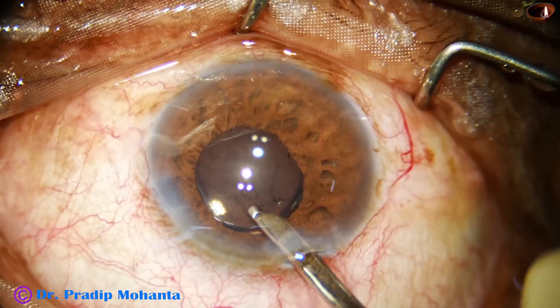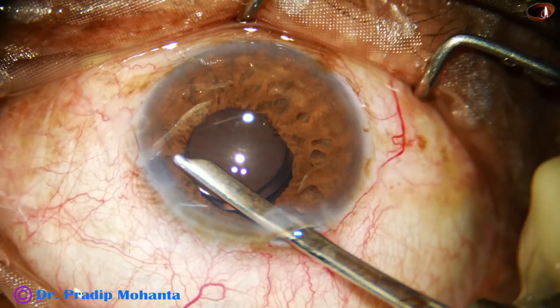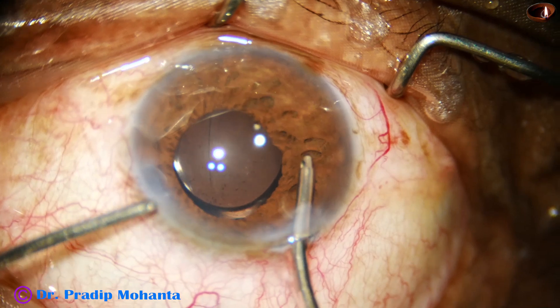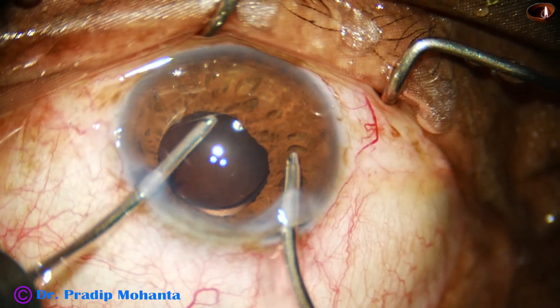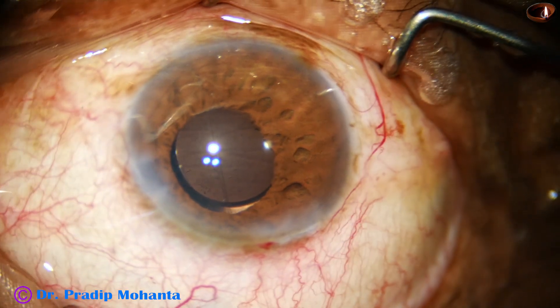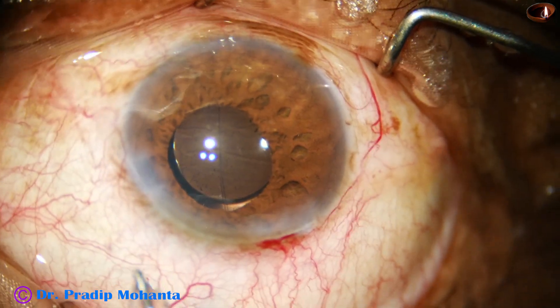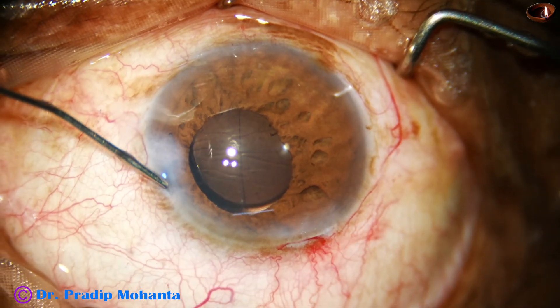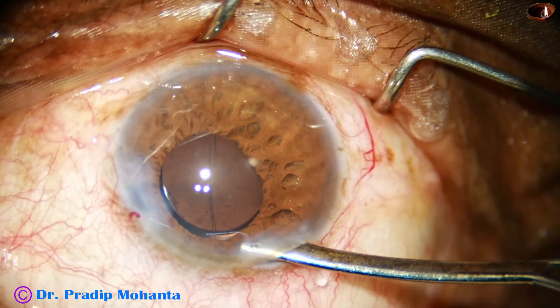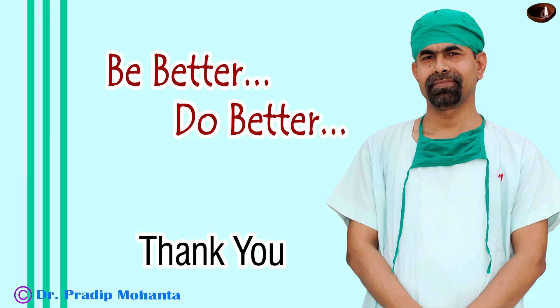Now we remove the viscoelastic substance. I go behind the lens and irrigate the space between the lens and the posterior capsule so that all the visco comes out from the capsular bag. Now I use bimanual irrigation-aspiration. The irrigation should be above the iris so that the iris doesn't prolapse — if the flow is in the center of the anterior chamber, the iris will prolapse through the main wound. The side port is closed by corneal stromal hydration, then a final lavage, and the anterior chamber is nicely formed with BSS. Few drops of Moxifloxacin are applied over the cornea. The case is concluded. Thank you very much for your attention.